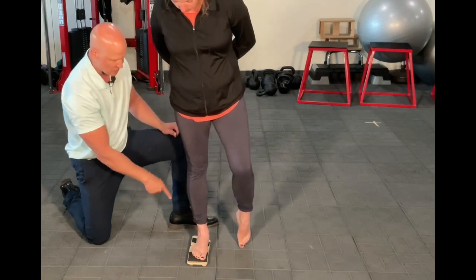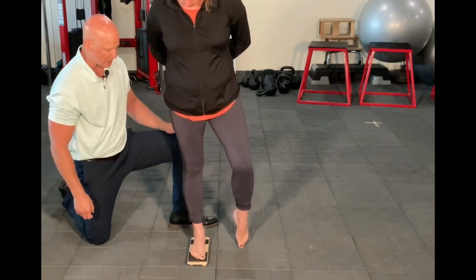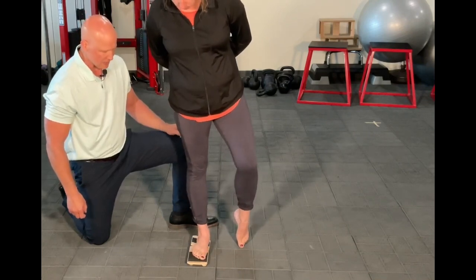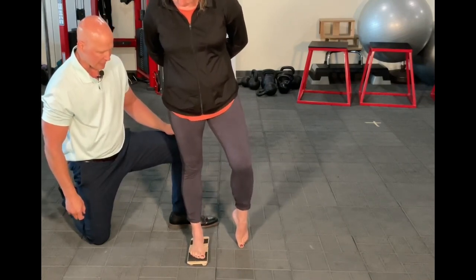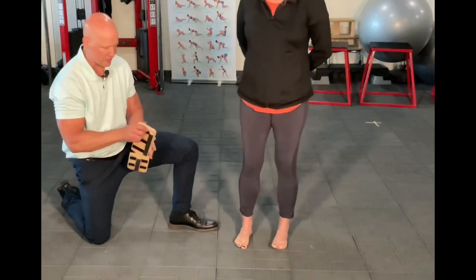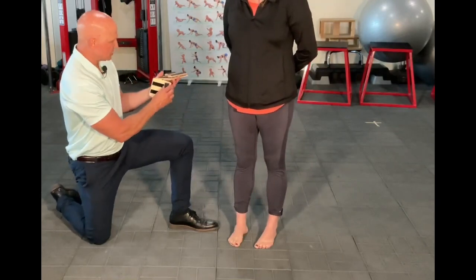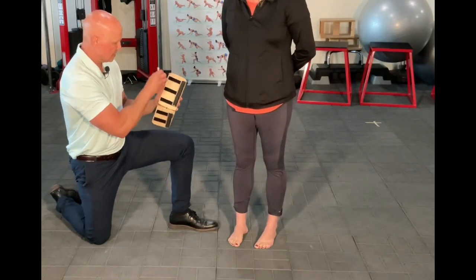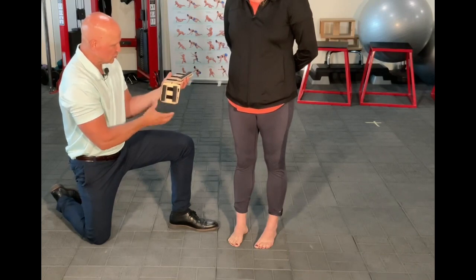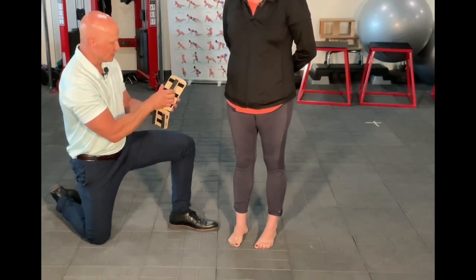Where she touches and comes back out of that, keeping 90% or the other way and come back from it, okay? So that is to mobilize what we call the subtalar joint. And then to get a little bit more of the mid-tarsal and forefoot, I am going to change the boards: the 2 short ones now on the bottom and the one larger dead in the middle.